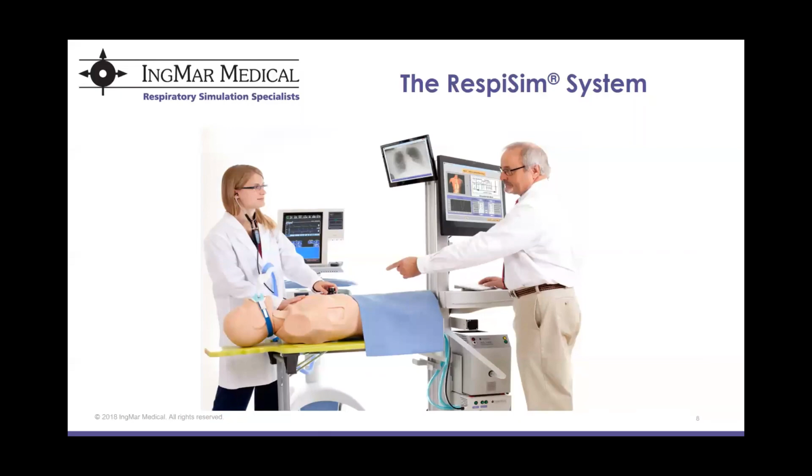Let me finish reading this question. Can you vent the mannequin with chest rise volumes? Yes, you can use any volume that a real patient can use, and you can also use any level of PEEP that is clinically significant. You can go up to, I think, a 40 of PEEP, but if you would use that. So anything you would do on a ventilator on a real patient, you can do with our system.